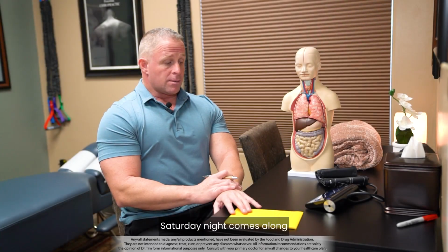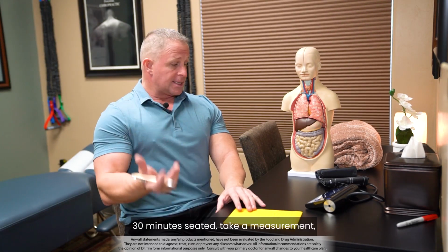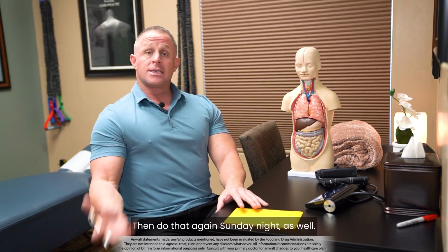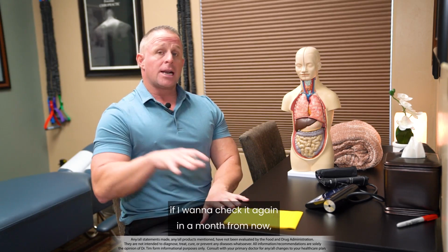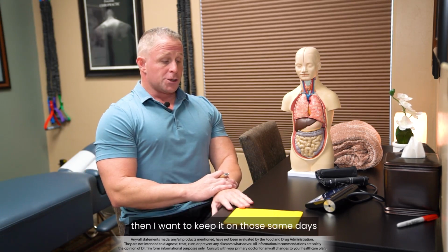Saturday night comes along, and I'm away from my busy day. It's the evening around the same time that I did on Friday, and I'm literally just gonna do the same thing. 30 minutes seated, take a measurement, write it down. 3 to 10 minutes later, take a second, and then a third one after that. Then do that again Sunday night as well. So it doesn't matter what days of the week you do it, just keep it consistent. So if I do that Friday, Saturday, Sunday this time, if I want to check it again in a month from now, if I'm doing certain things that are going to help my blood pressure, exercising, taking supplements or whatever, then I want to keep it on those same days so it's consistent.